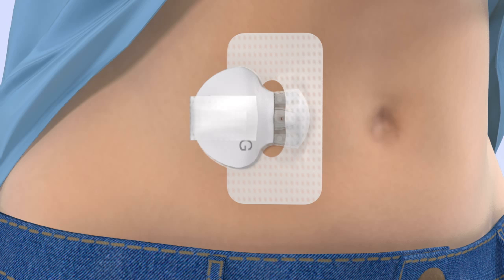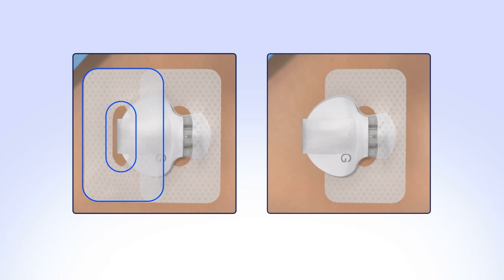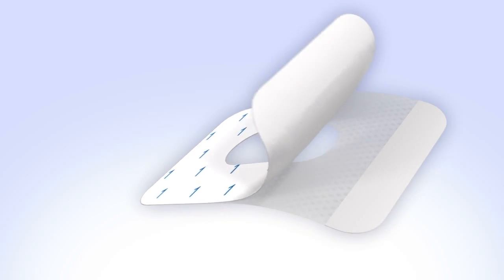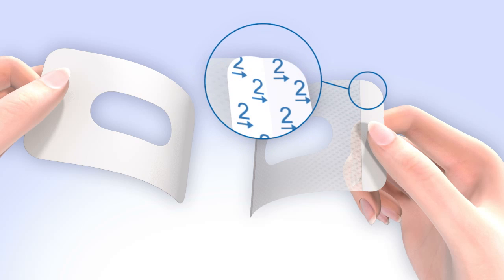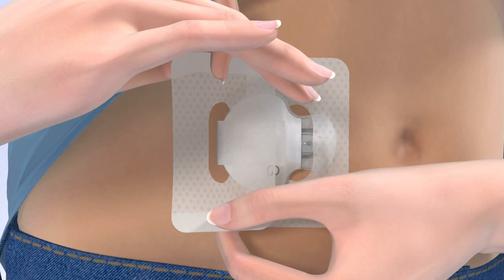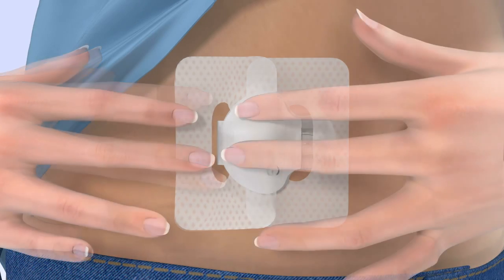Now you need to apply a second piece of overtape to the sensor and transmitter. There are two options. Option 1 leaves the back of the transmitter open to allow for better ventilation. To apply Option 1, remove the paper backing marked by the number 1. Do not remove the number 2 paper backings just yet. Hold the overtape by the covered ends and position it the same way as the first piece of tape. Apply one side of the overtape so that it covers the center of the transmitter and apply the other side directly on your skin. The hole in the center of the tape should expose the back of the transmitter. Smooth down the tape on your skin and transmitter. Finally, remove the paper backing marked number 2 and press the remaining overtape against your skin.